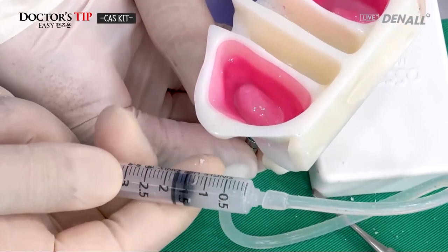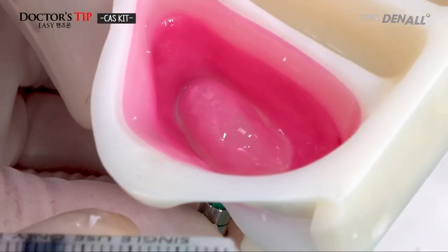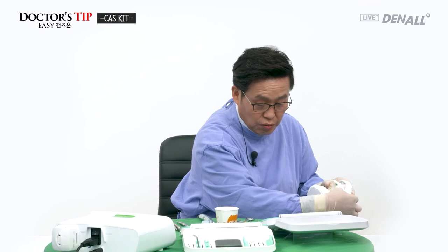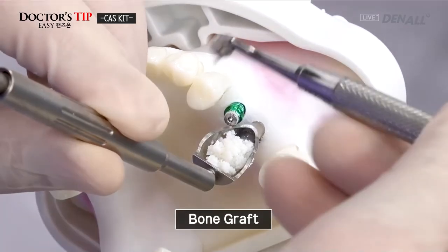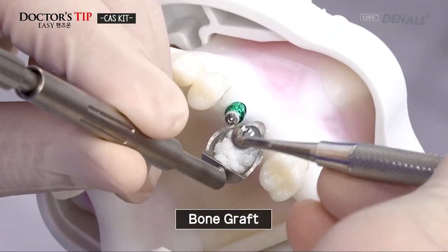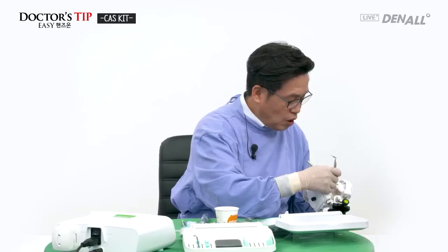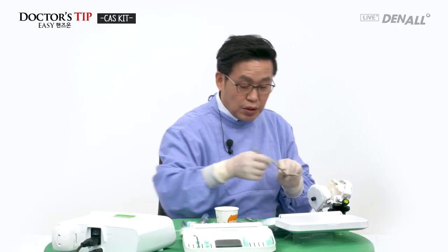Aspiration. Negative pressure is formed, so it doesn't move anymore. We will do the bone grafting again and place the implant. Bone material is inserted and it is pushed in with the bone condenser. Due to the hydraulic lift, the water is coming out.